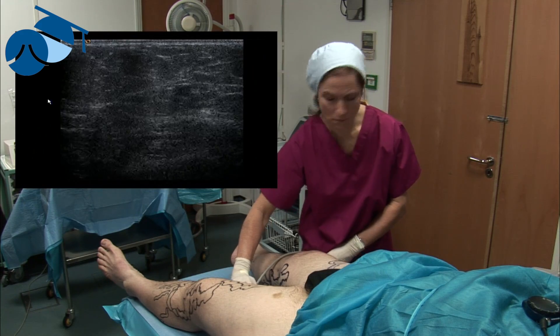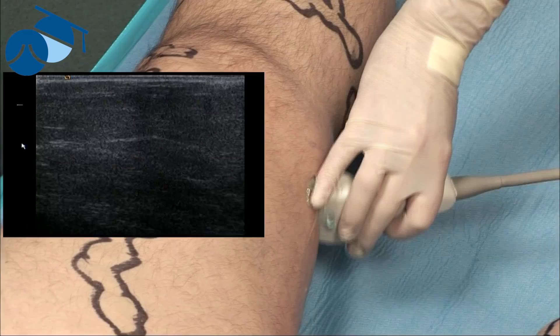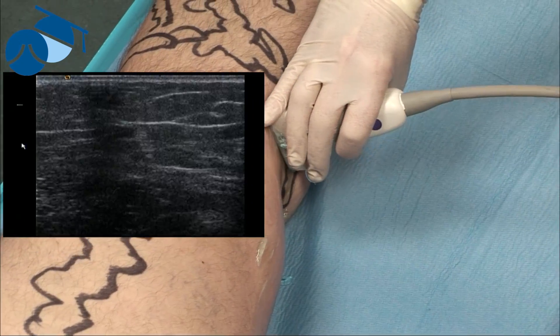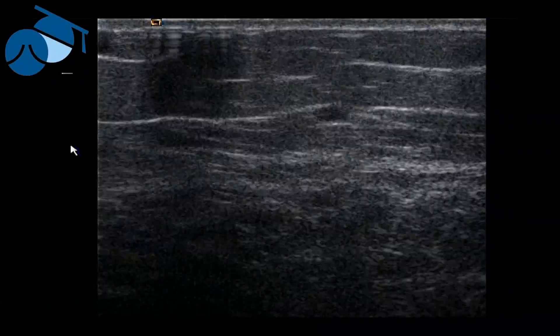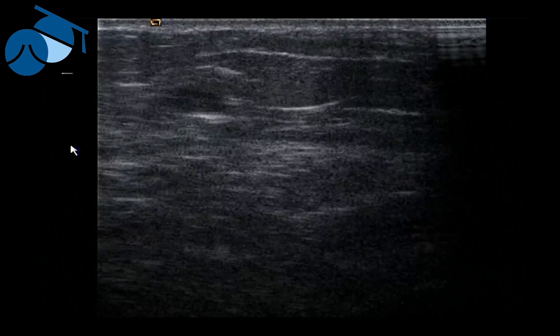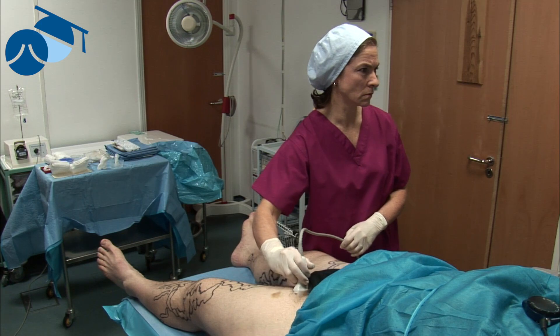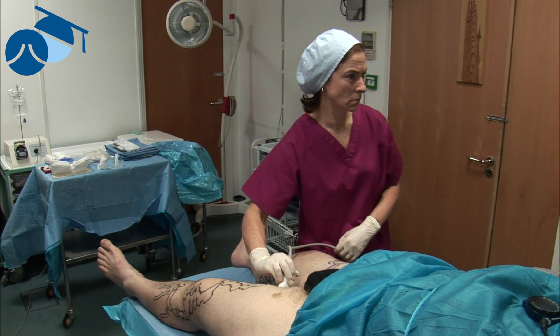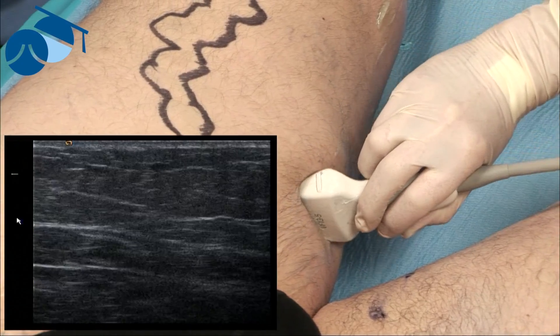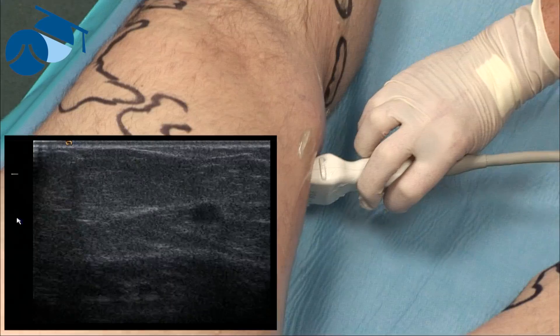In fact it's not looking too bad, so we should be able to get all the way up with the endovenous device. This is quite important if there's a suggested atrophic segment, because halfway through the procedure if we can't get the device all the way up, we make a second entry point above the atrophic area — treating from distally up to that area, then doing a second entry point just above the atrophic segment before putting the tumescence in.